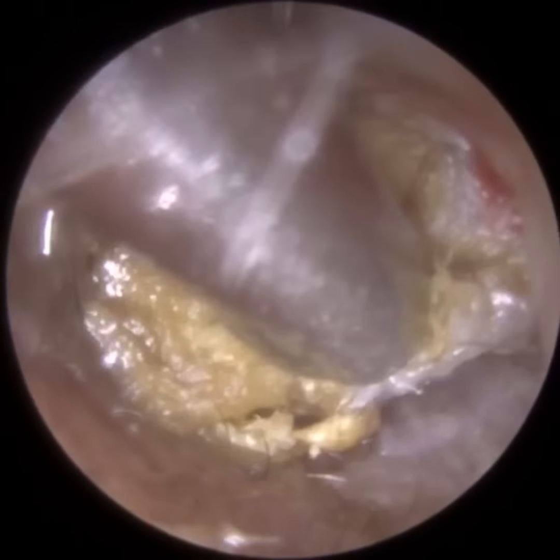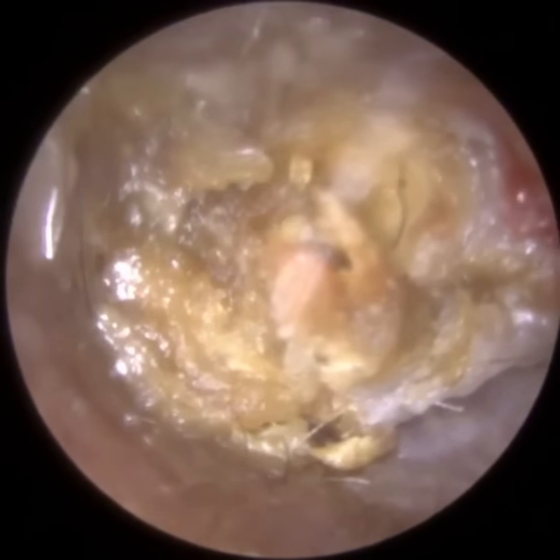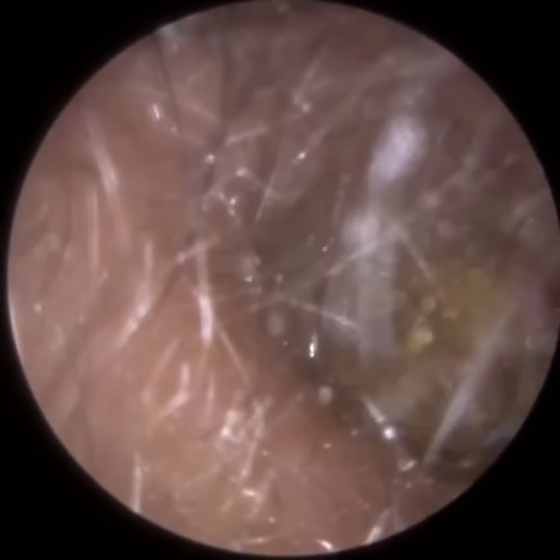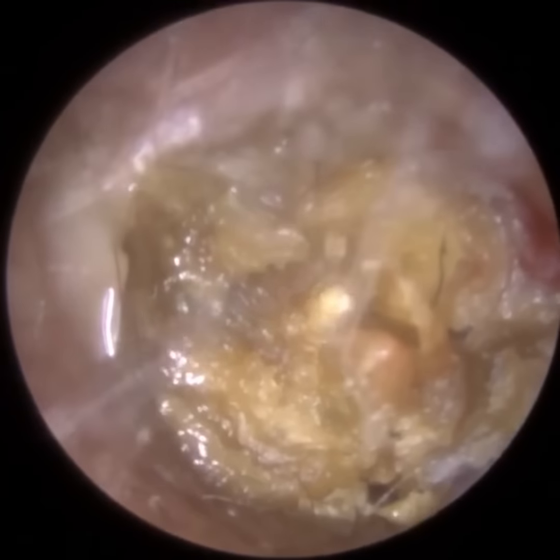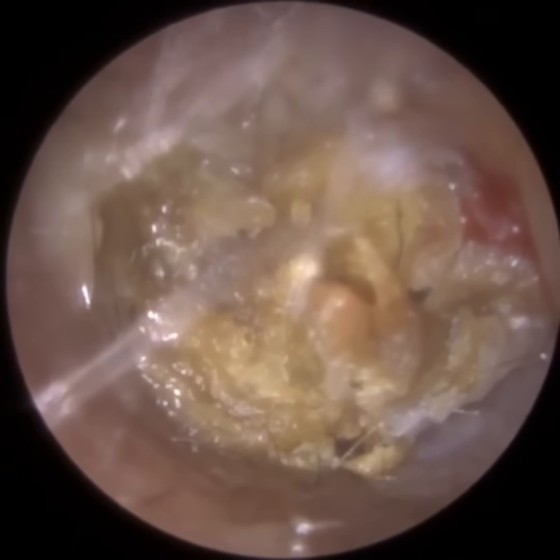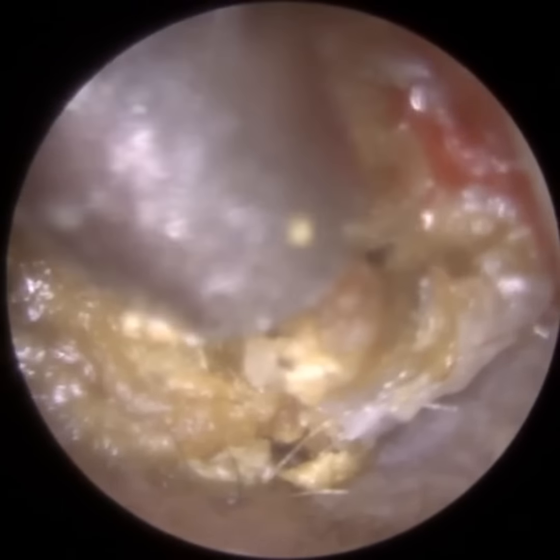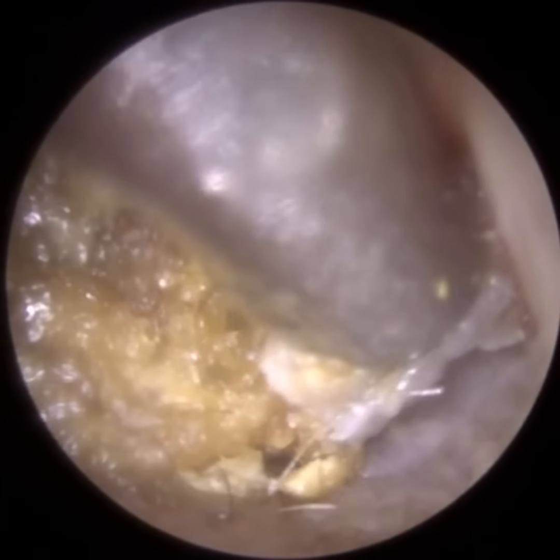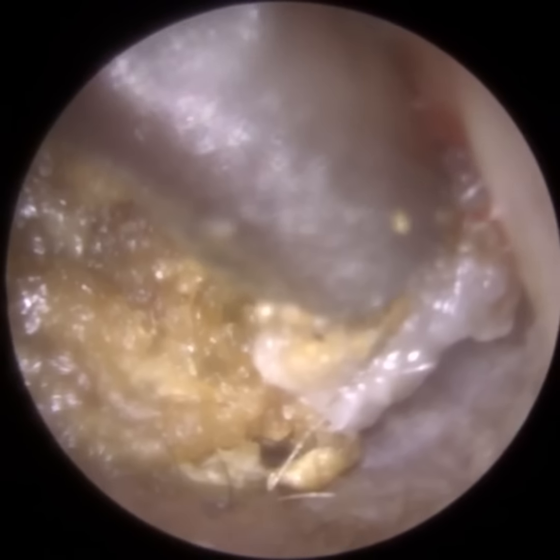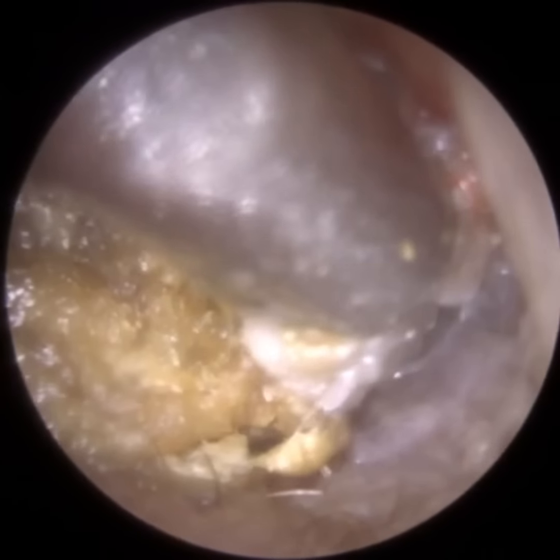So you can see from the plug, the outer part of the plug, you've got the fresh dead skin, so that's white in appearance, and then as you go to the middle of the core, it gets darker. It's almost like a rainbow effect, or different shades of yellow. The outer part, it's white, fresher skin, and in the middle, that's the older skin, and that's oxidized, so it's a darker, it's almost brown, and you can see the change in colour.